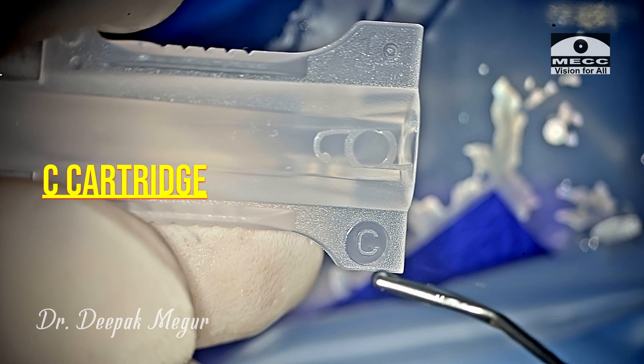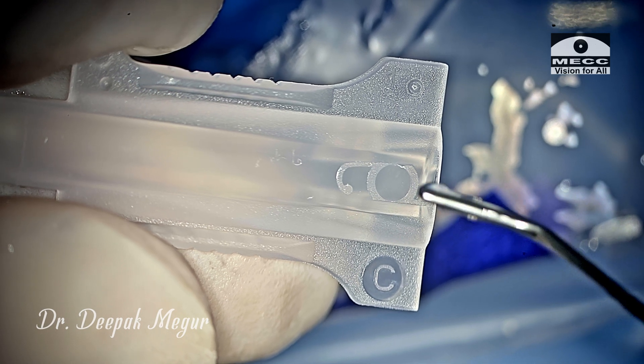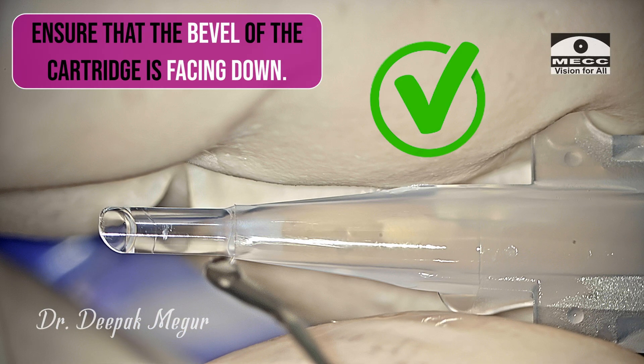Let's see the right orientation of the cartridge first. This is a C cartridge. The way it has to be held for loading is: the nomenclature of the cartridge — that is 'C' — has to be facing up, and also the symbol of the IOL has to be facing up. This ensures that the bevel is down and this is the right orientation.